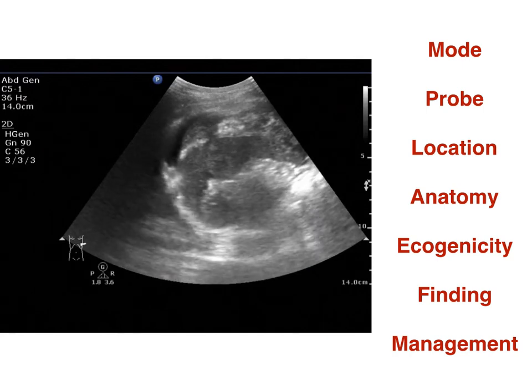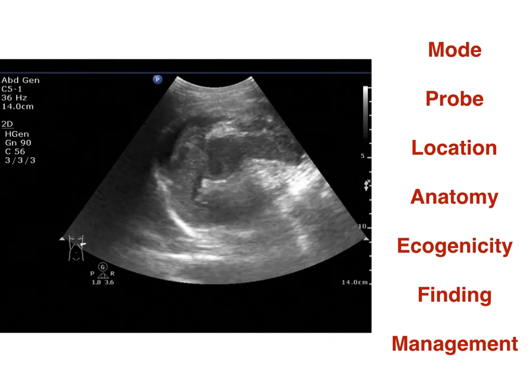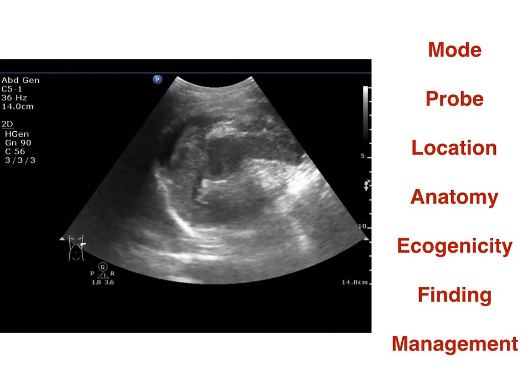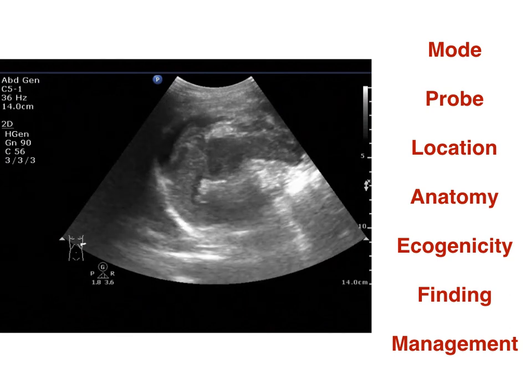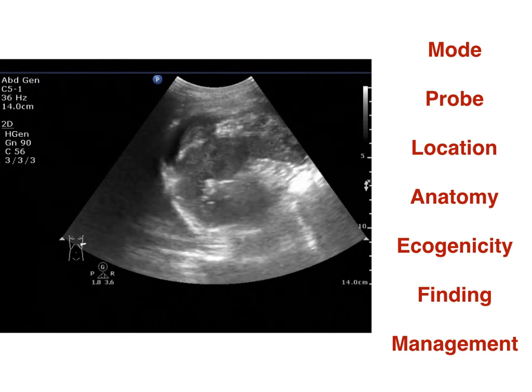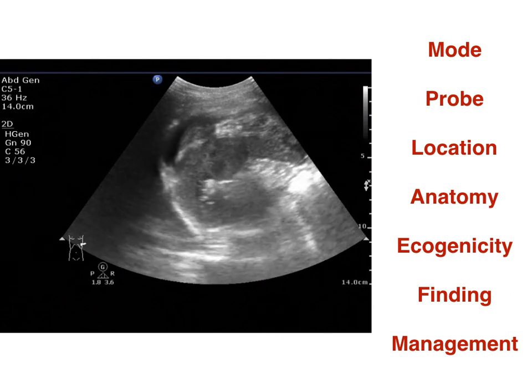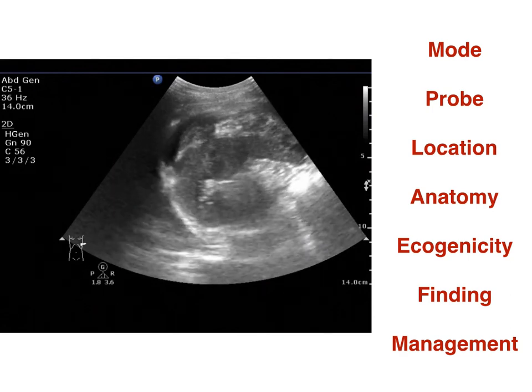Then move back. So if we are trying to teach and recognize the echogenicity, the beauty of B mode, the brightness mode, see this one. Anechoic, isoechoic, hypoechoic, hyperechoic mean normal, free fluid, echogenic fluid, and disruption of the echotexture of the spleen, right?